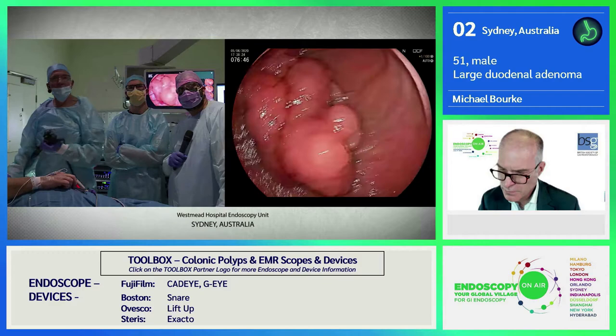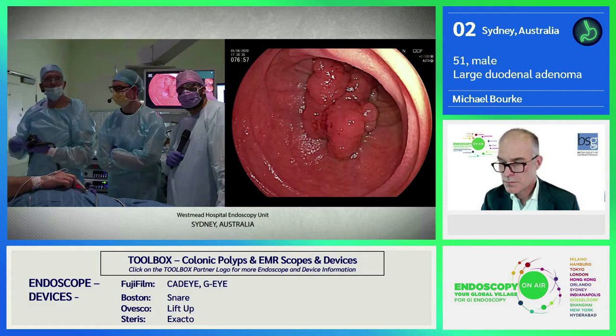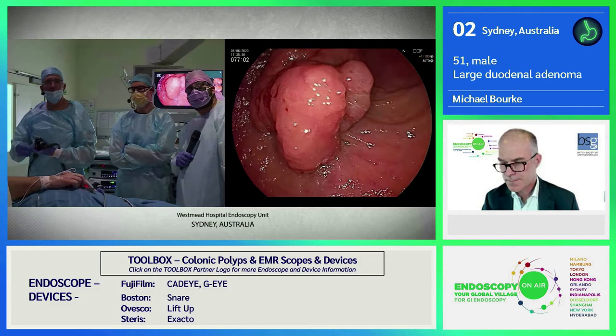Otherwise you're risking pancreatitis. So you must always know where the papilla is, and if you're not sure, you put down a side viewer. Okay, so there is a major risk of bleeding afterwards, which for polyps larger than 3 centimeters is 25%.